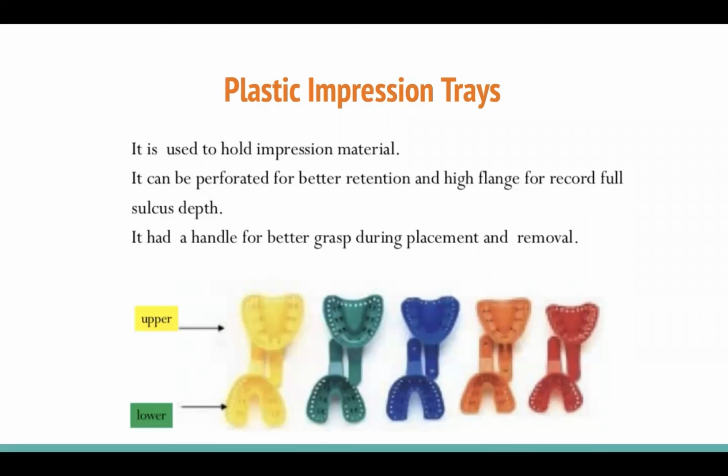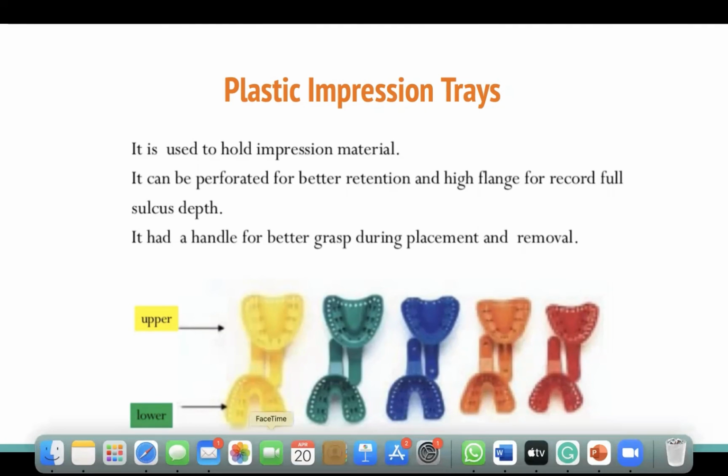They are usually perforated for better retention. They have high flanges to record the full sulcus depth. It has a handle for better grip during placement and removal. For orthodontics, we only use the plastic trays.